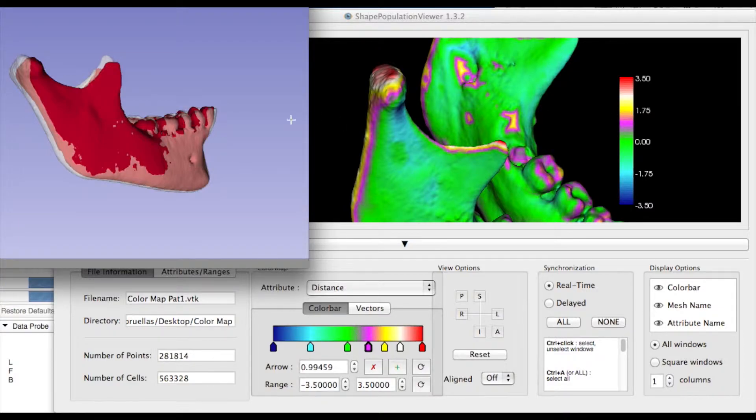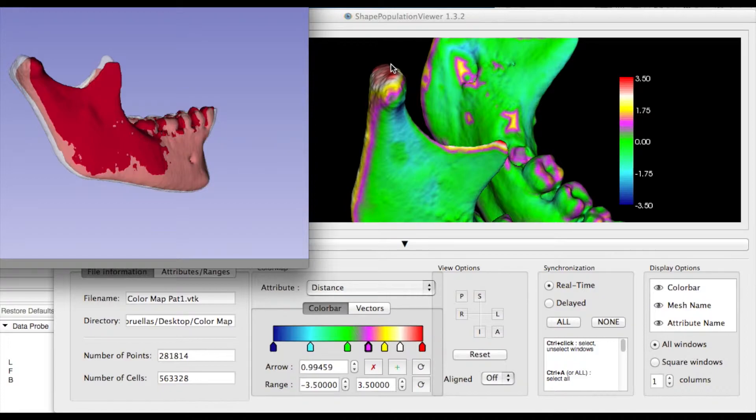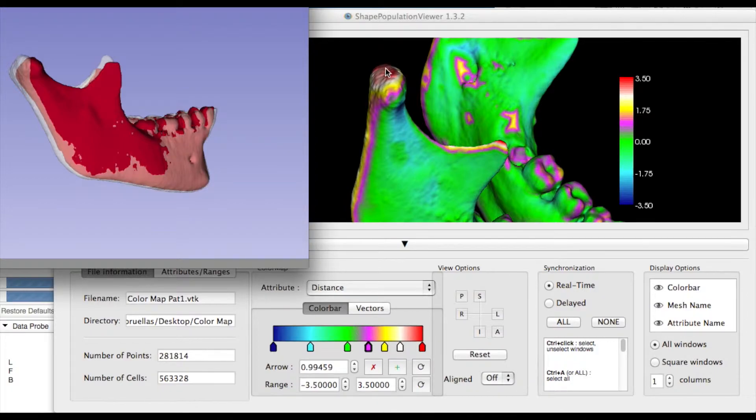In the condyle area, growth was in the posterior superior direction and was more evident than in the posterior area of the ramus, reaching 3.5 millimeters in some specific red regions.